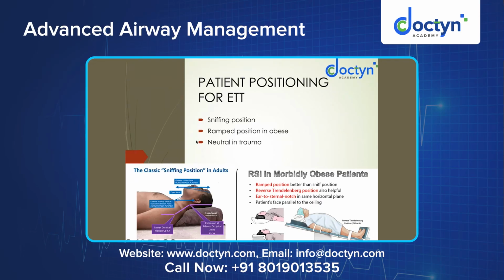Again, in a trauma patient where there is a risk of C-spine injury or suspicion of C-spine injury, you maintain a neutral position.